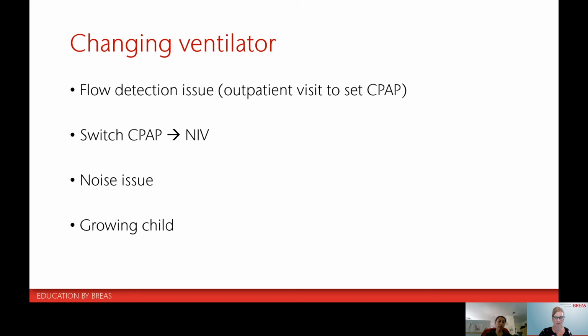So we sometimes change the device because of this. And the last point, but maybe there are other points, but for us according to our experience until now, this was the main issue: the child is growing. For example, you have an infant that required CPAP or NIV that you put on life support, and this child still needs NIV or CPAP for a long time, and is growing, and then you don't need to keep him or her on a life support anymore, and you decide to change.